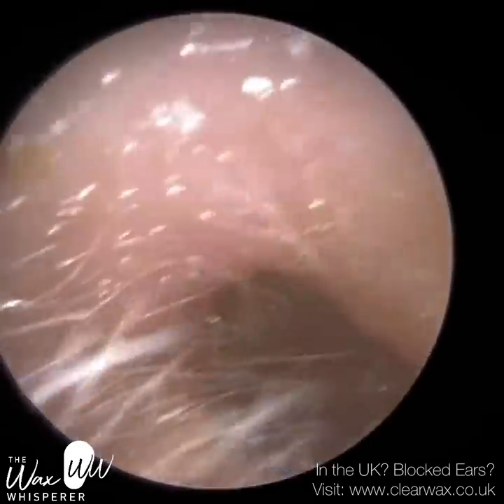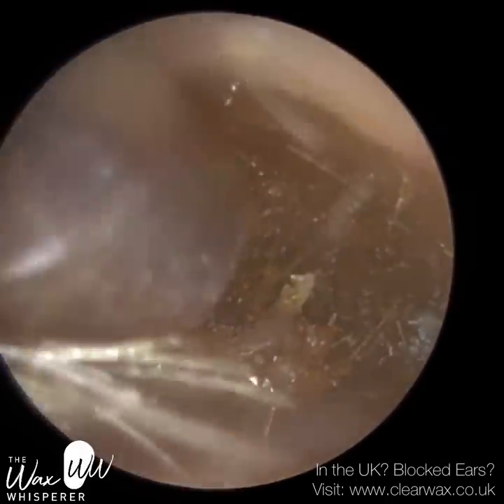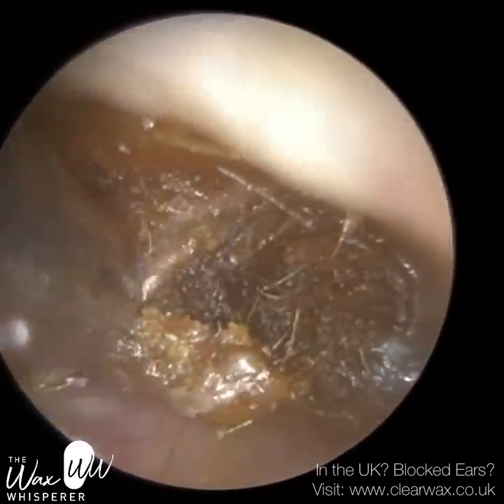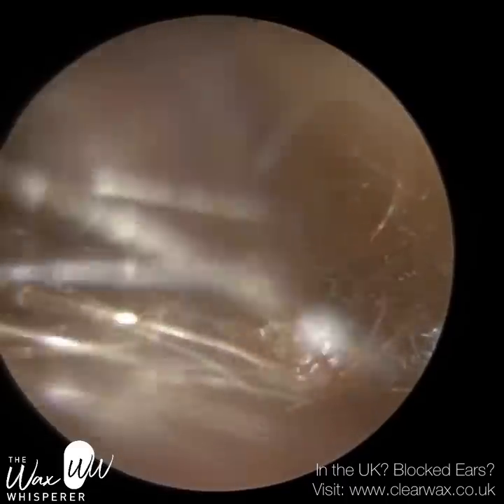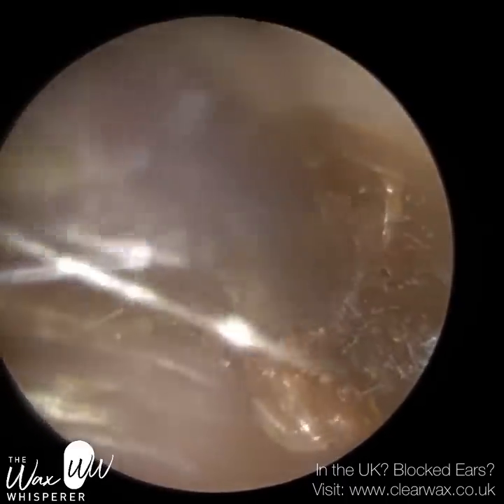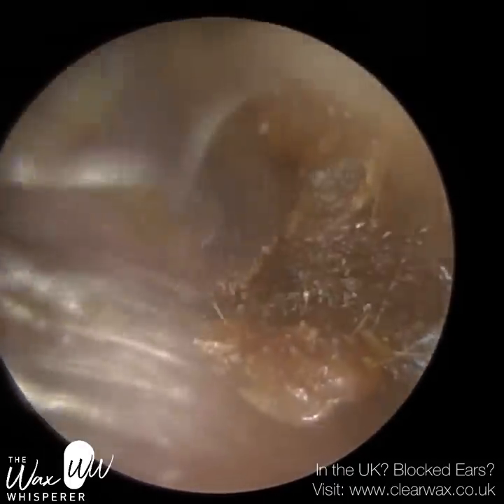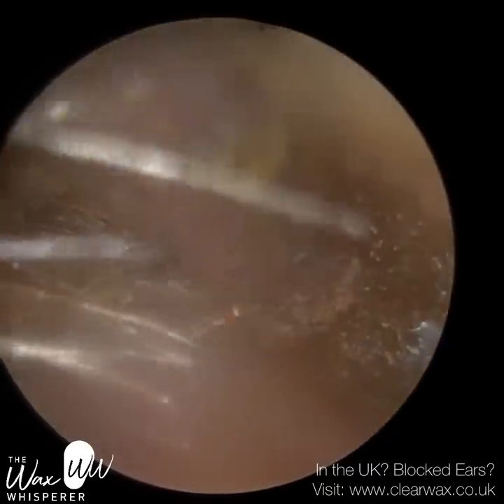I did need to use the oil, because it would be very hard to remove this plug of wax otherwise. It's just too deep to use a Jobson horn or an ear hook. In fact, an ear hook would just slice through this. A Jobson horn would have to go in and behind the wax plug, making contact with the canal wall, which would have been really uncomfortable for the patient given that we're on the bony, osseous portion of the ear canal. If the wax was on the outer third — the cartilage portion — we could glide instruments over the wax plug up against the canal wall, because it would be less uncomfortable for the patient.